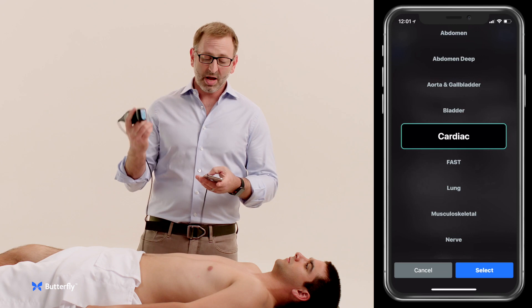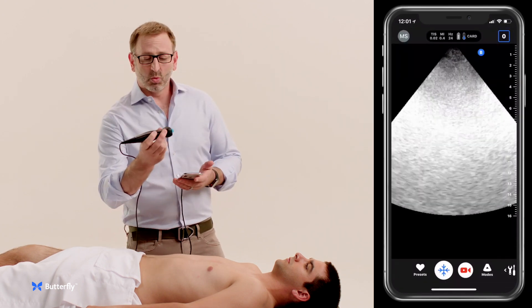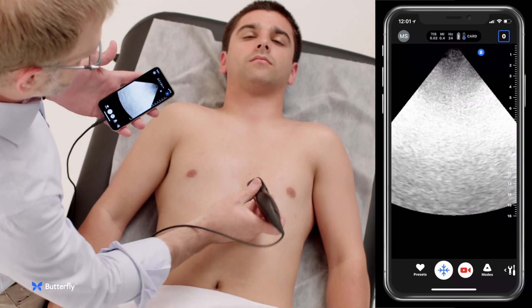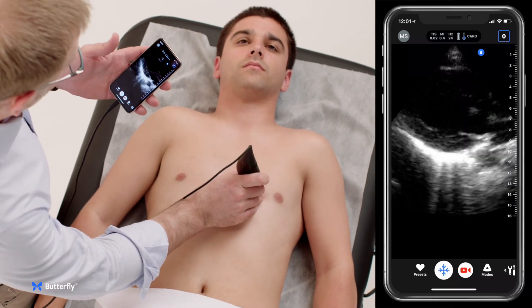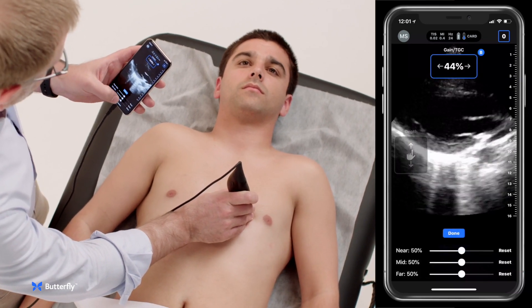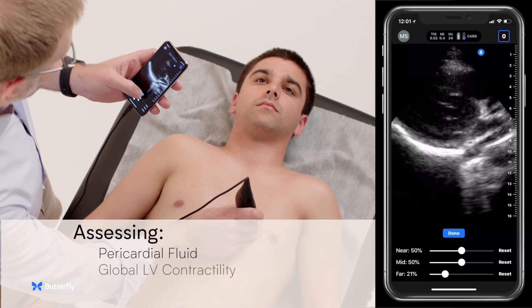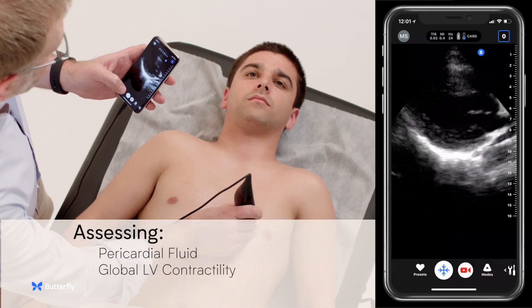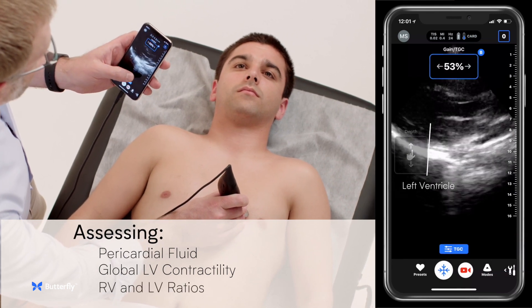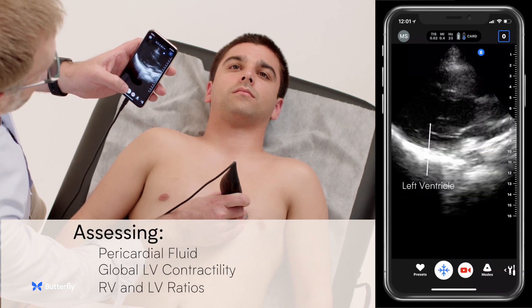To start, we'll pick a cardiac preset and get parasternal views first. We'll put the transducer just to the left of the sternum with the indicator up towards the patient's right shoulder, giving us a parasternal long axis view where we're able to assess for pericardial fluid, look at global LV contractility, and get a general sense of RV and LV ratios to look for RV strain or enlargement.